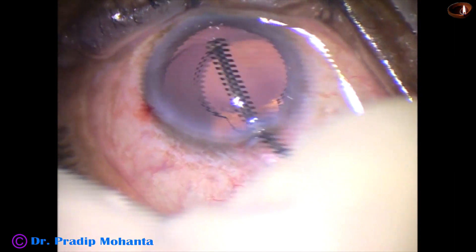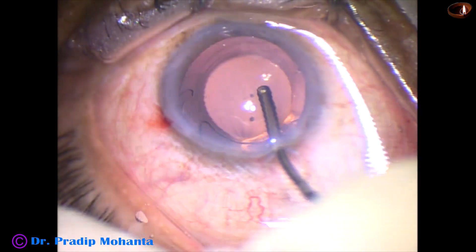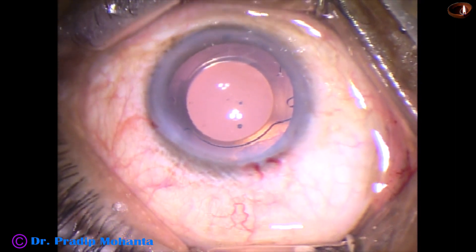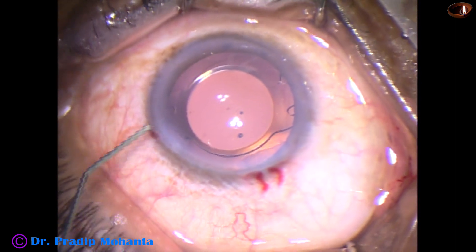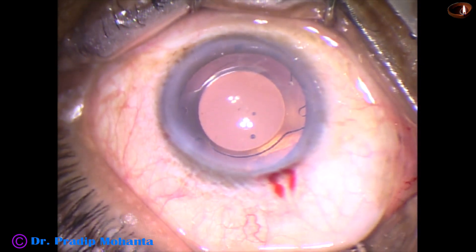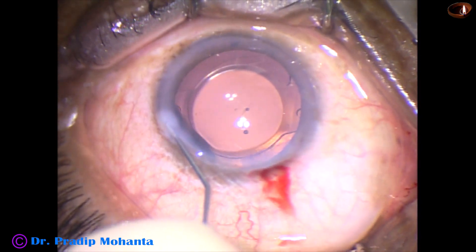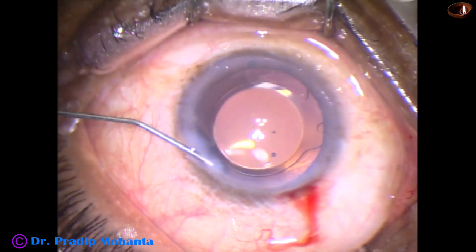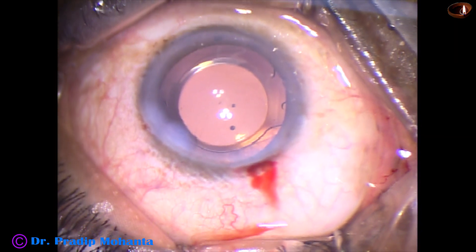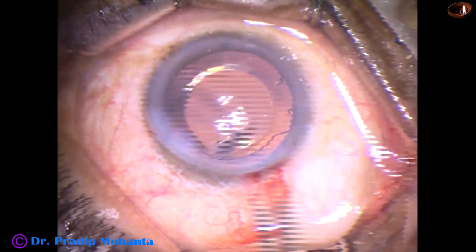No financial interest of mine in any products mentioned in this video. And now we are done — we just have to do some final steps. This is a bit of moxifloxacin. The side port is closed by hydrating the corneal stroma with BSS. As the stroma becomes thick, the lips of the wound get opposed to each other and the opening closes.